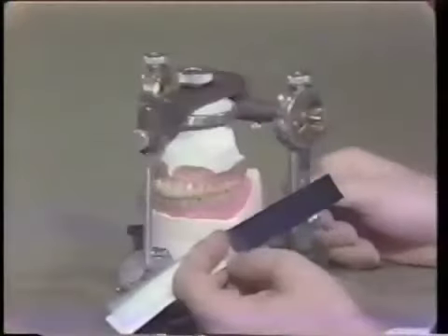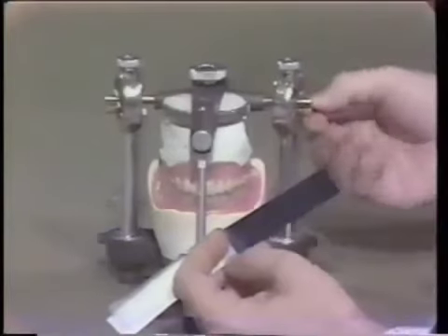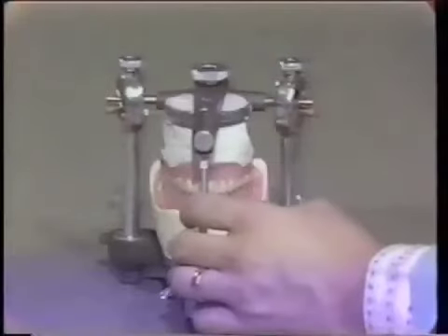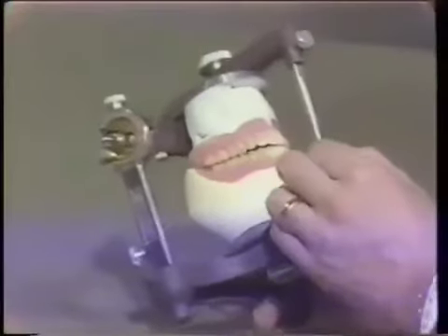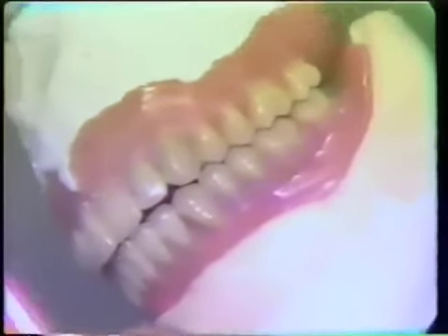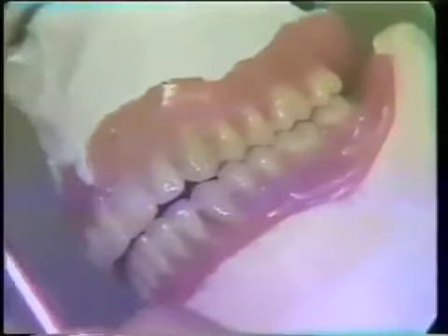As we discussed in lecture, the first thing we do is loosen up the articulator so it can go into the excursions, and move the articulator back and forth to see if we have any tooth that interferes in all positions — working, balancing, and protrusive. If this happens, the tooth has probably moved during processing and we will have to adjust the cusp tip. But when we adjust the teeth in centric occlusion, we do not grind cusp tips.